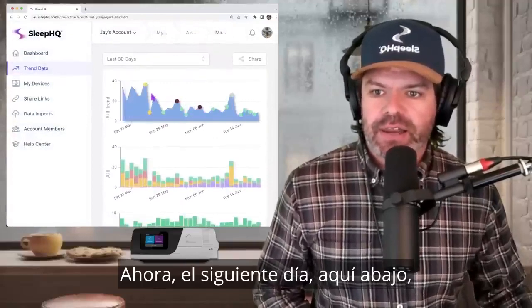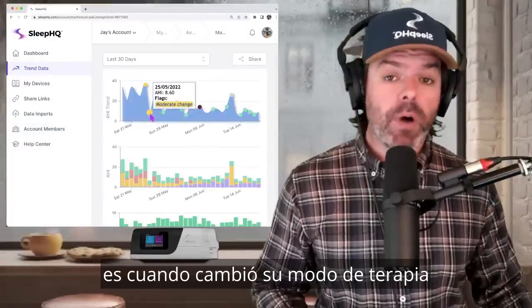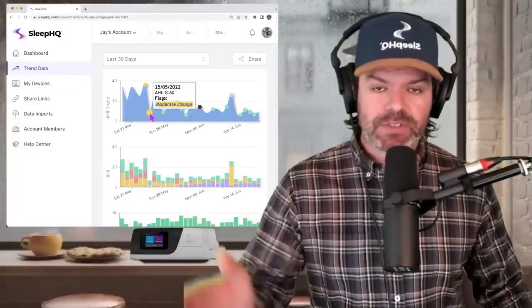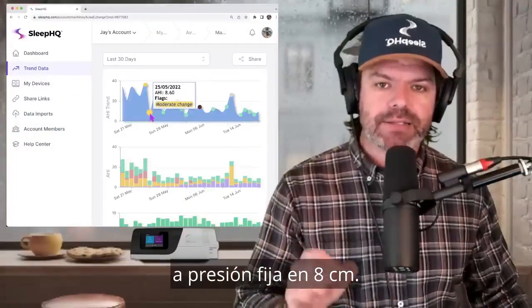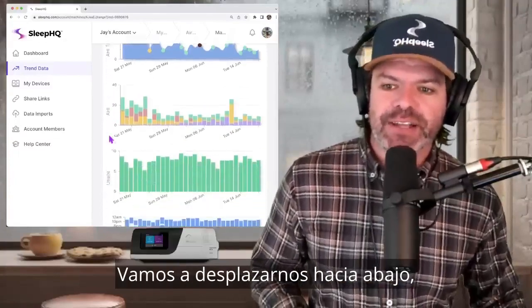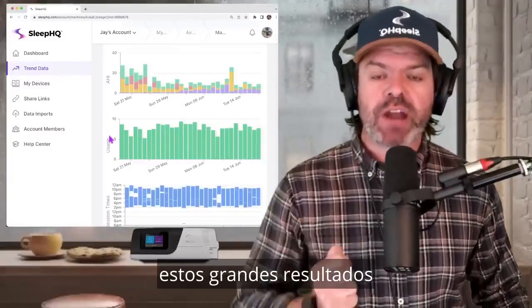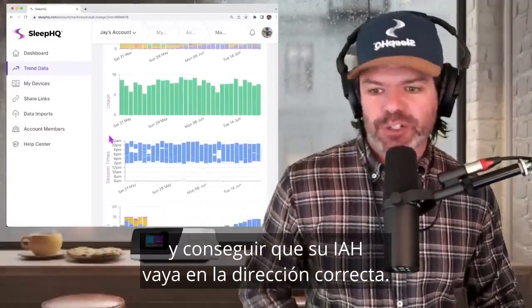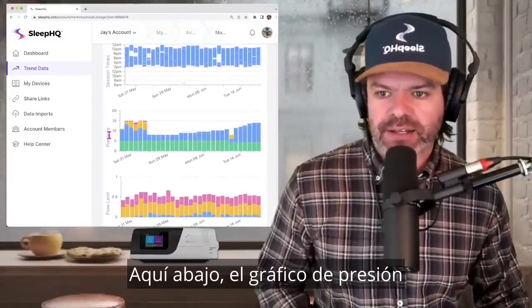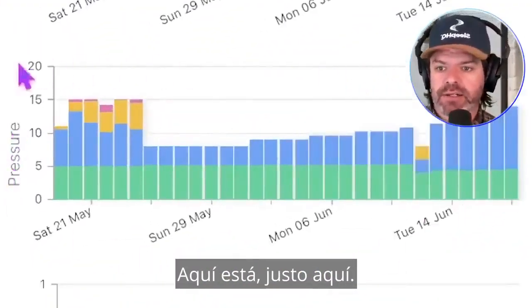Now, the next day down here is when he changed his therapy mode from automatic to fixed pressure on 8 centimeters. And you can see straight away there was a great big drop. Let's scroll down and I'll show you this really simple method that Jay is using to achieve these great results and get his AHI trending in the right direction. Down here, the pressure chart over the last 30 days. Here it is right here.